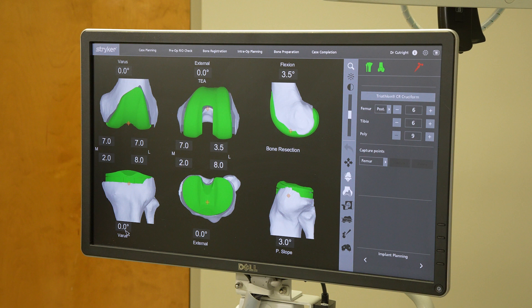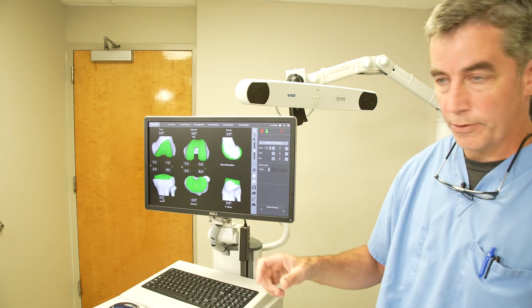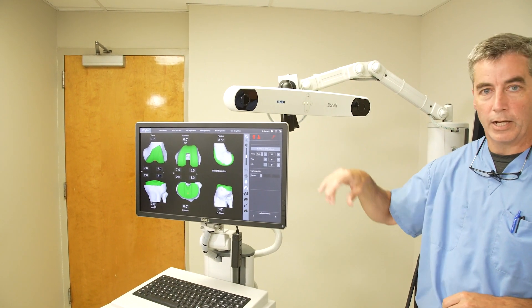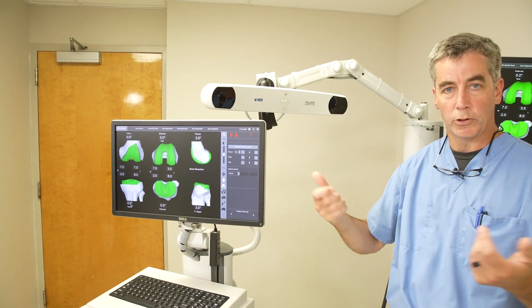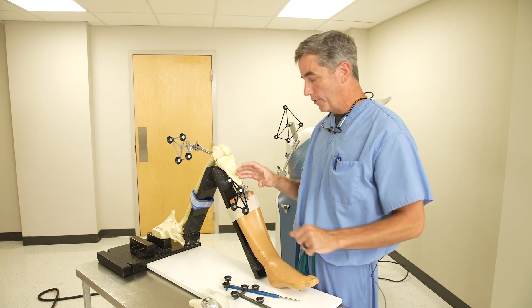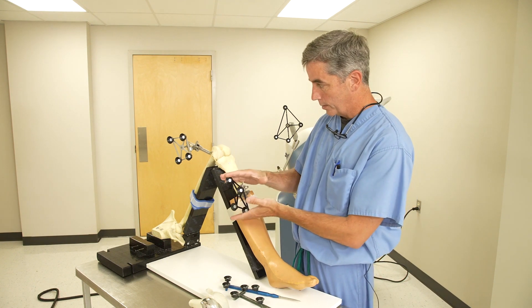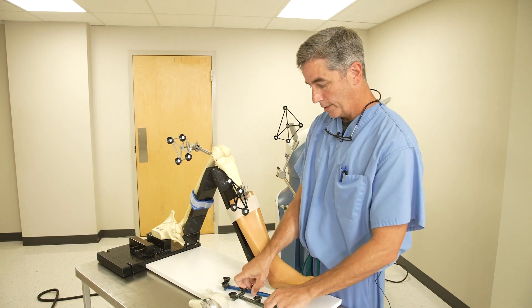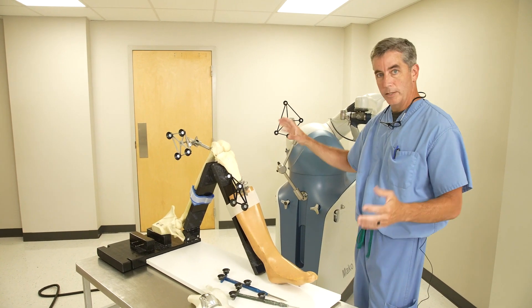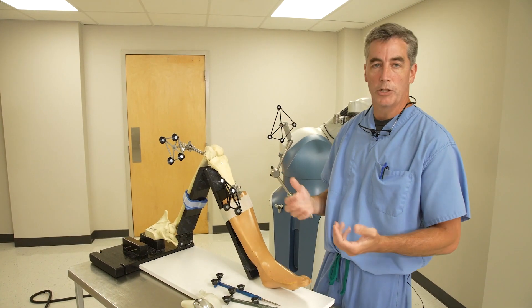The computer talks to the robot and basically to me on the surgical field through this device here. Think of it kind of like an infrared device or the remote control on your TV. So that device on the computer talks to these two things right here and this on the robot, depending on what we needed to talk to.